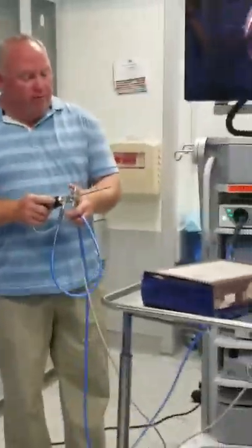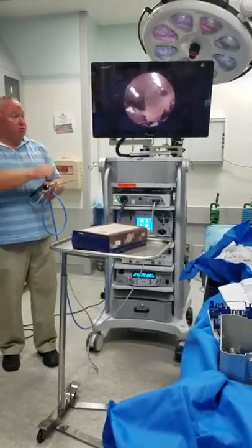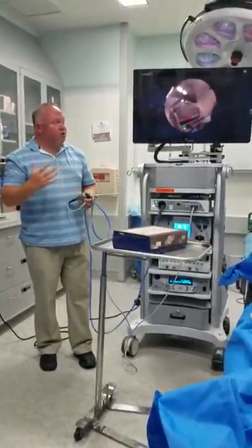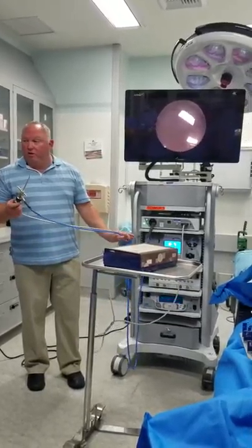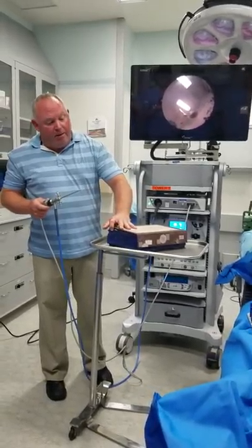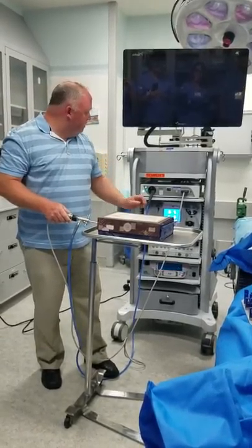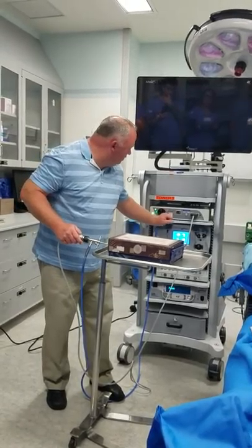Okay, we put fluid through here, we have a pump. Sometimes I'll just do gravity flow where basically it's just a tube and the fluid on an IV pole. Most people use a pump because you can control the amount of fluid you're getting, but not always. They're introduced into the patient, okay? So this is not a patient, this is a box that I made. Basically it allows you to get the same idea. So, light up. See, my machine is trying to get the light higher.